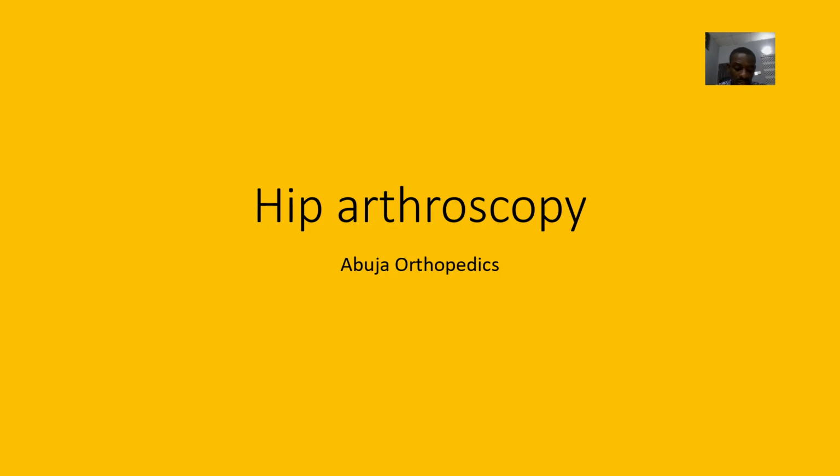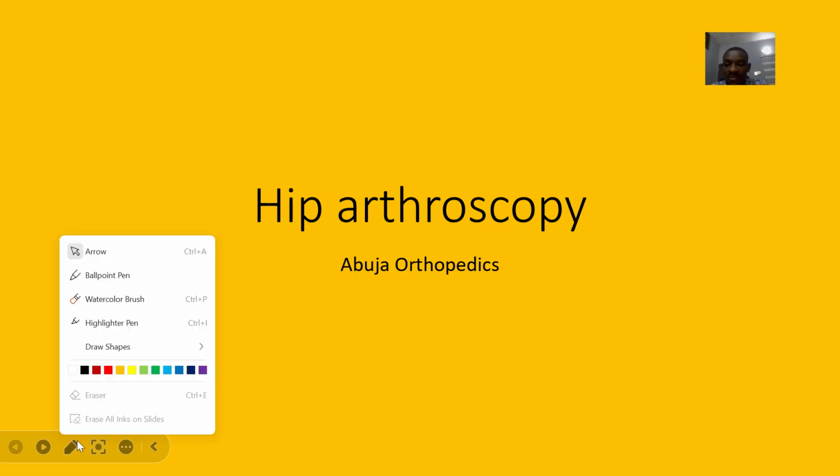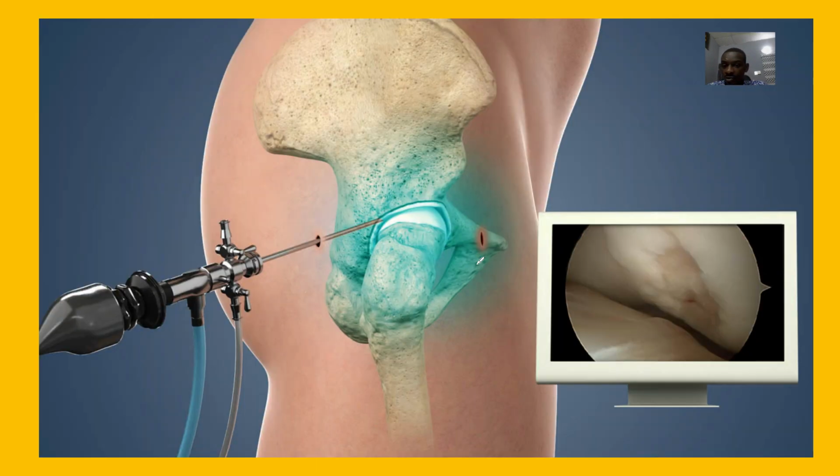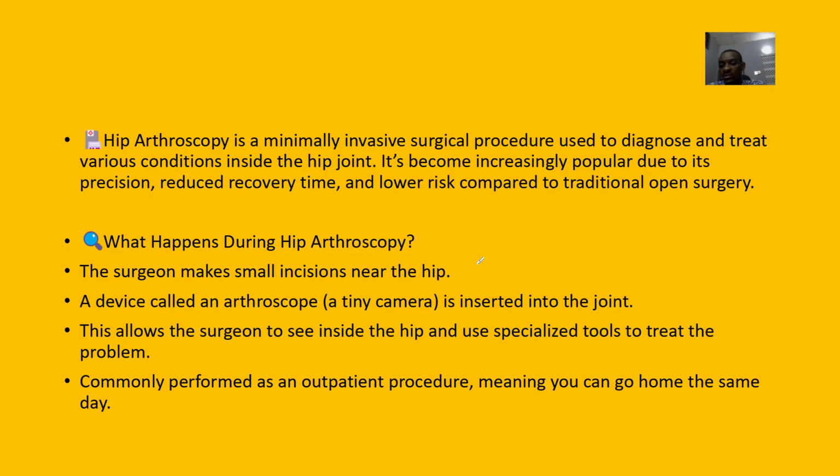Now for next off, we're trying to look at what's known as a hip arthroscopy. Alright, hip arthroscopy. So for this hip arthroscopy, you could say it's just a minimal invasive surgery.